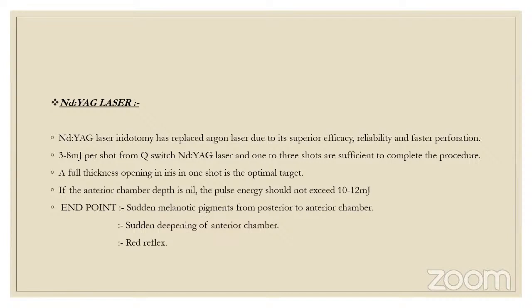Generally, Kishan, you are doing the triaging in the OPD. How do you check the anterior chamber depth? Sir, by torchlight examination. On torchlight, if you feel the angle is very shallow, then there is no need to dilate. If you feel on torchlight that the angle is shallow, then better to get the anterior chamber depth done. If it is too shallow, it should be seen by the consultant. The patient may be advised a YAG PI before undergoing dilatation.